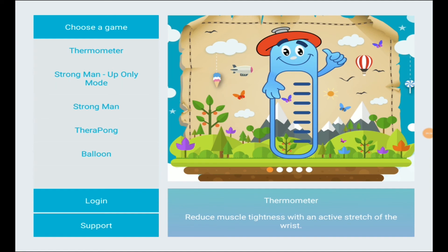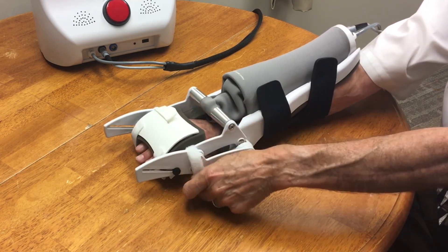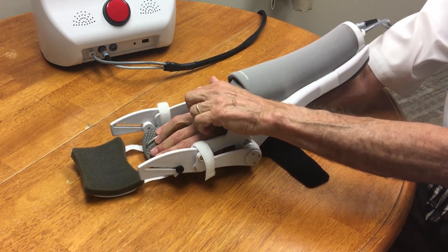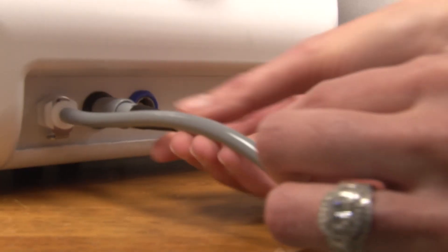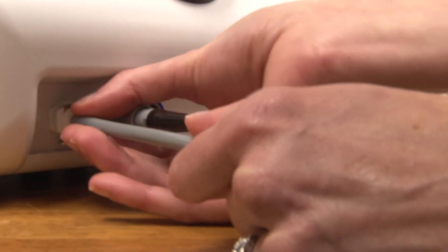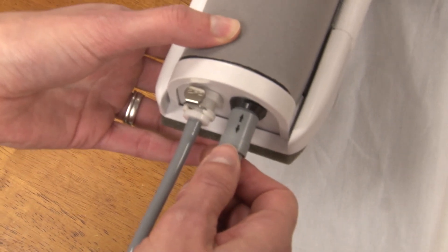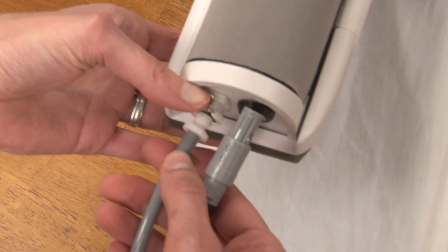Now you can take off your Hand Mentor. When disassembling, first unstrap the foam finger support, then unstrap the forearm straps, and slip your hand out of the Hand Mentor and lay it back on the table. To disconnect the cords from the control box: grab the gray cord by the sides and pull straight out — do not twist. For the white cord, press down on the silver clip on top and pull straight out. Repeat the same steps to remove both cords from the Hand Mentor itself.